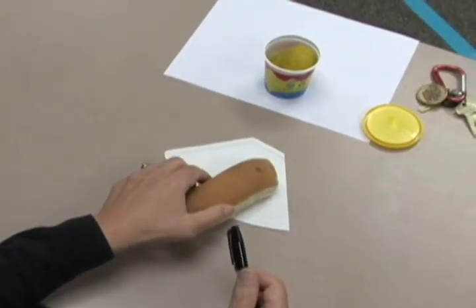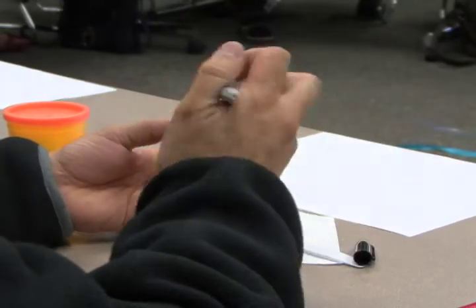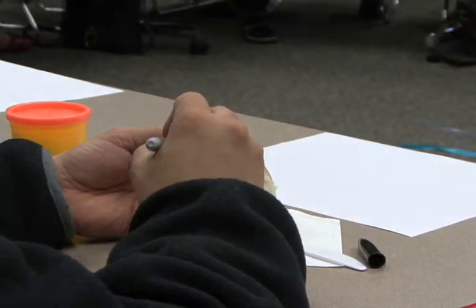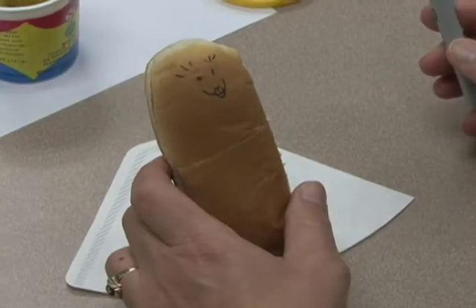So I'm going to talk a little bit about image orientation. So I want you to take your hot dog bun, and this is your patient, so please be careful with it. And I would like you to draw a face on one end of the hot dog bun. And we like happy patients. Okay, so we're going to learn the different orientation. So we all know the midline of the body is directly in the middle of your hot dog.